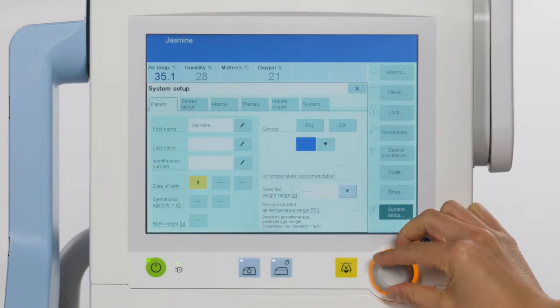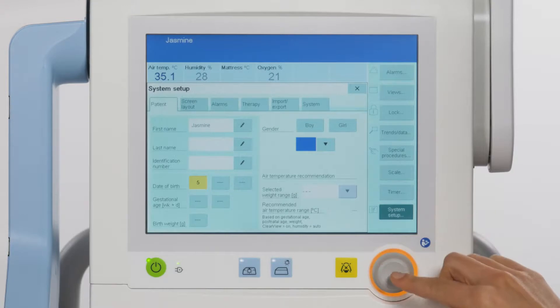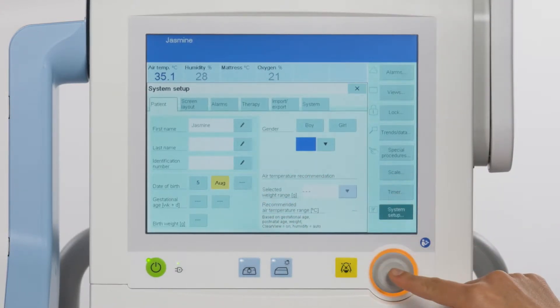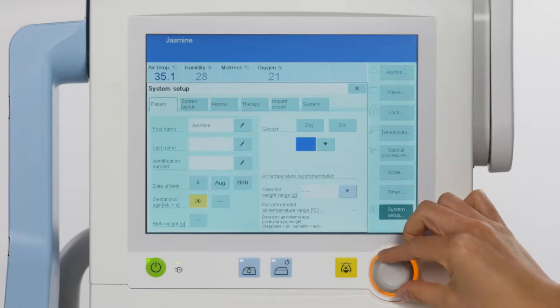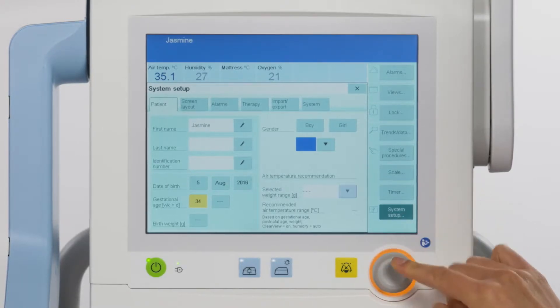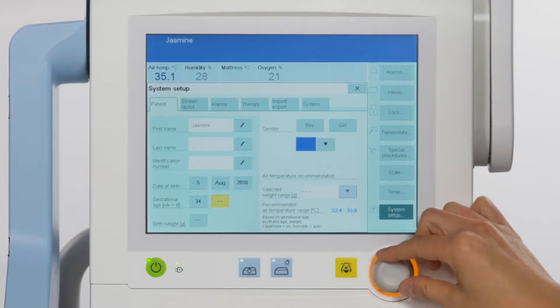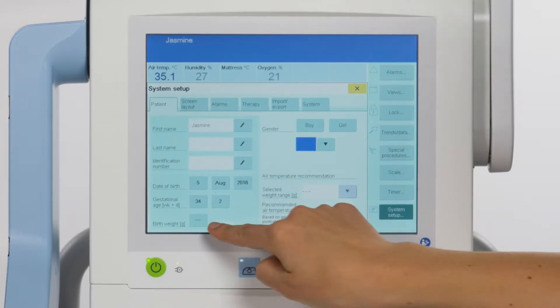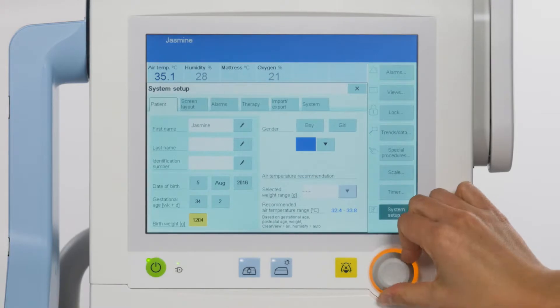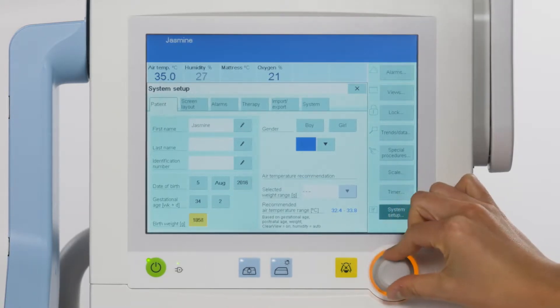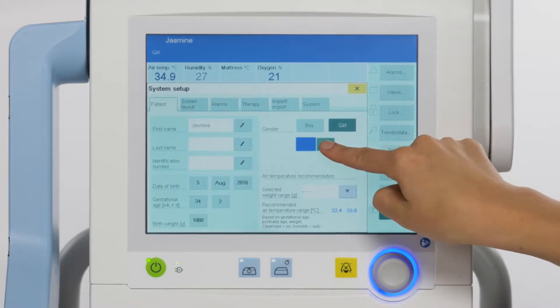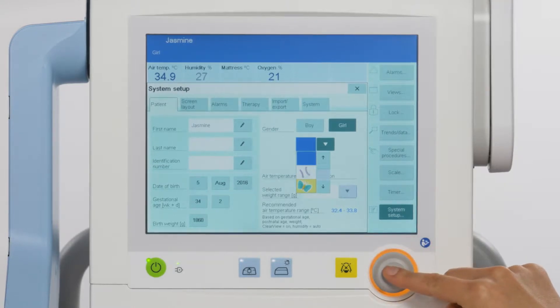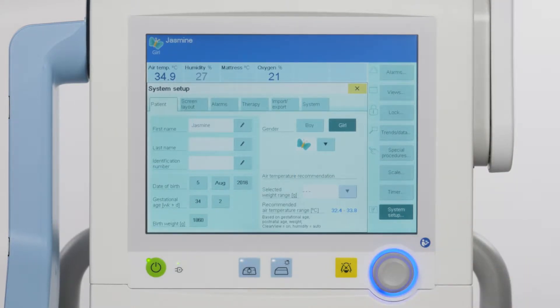You can also enter date of birth, gestational age in weeks plus days, and the infant's birth weight in grams. Afterwards, touch a button for the gender and select a symbol for the patient from the list field. Both will be displayed in the header bar and the family screen view.